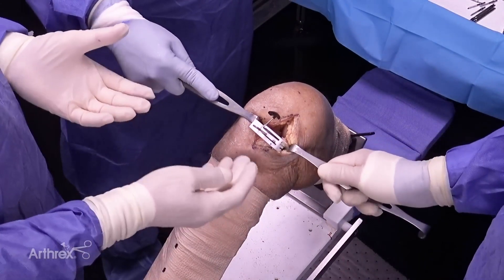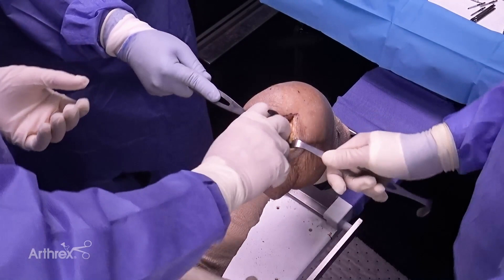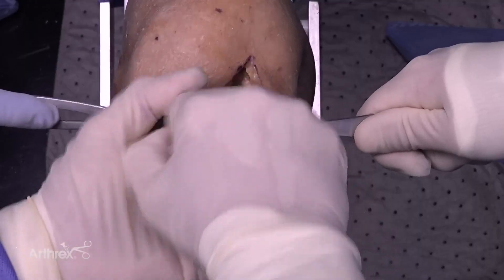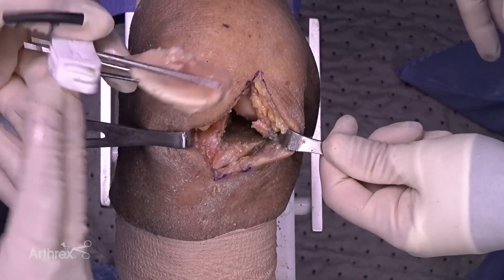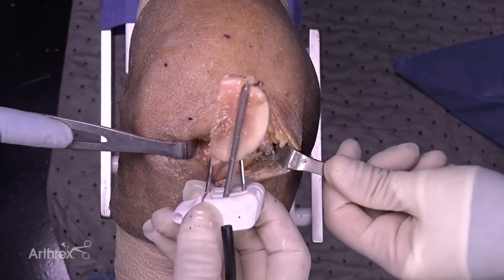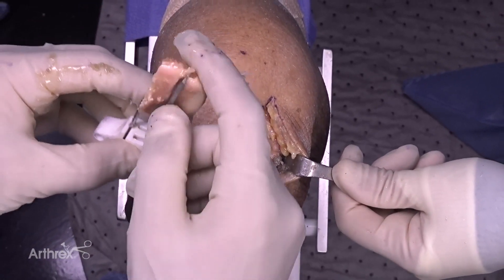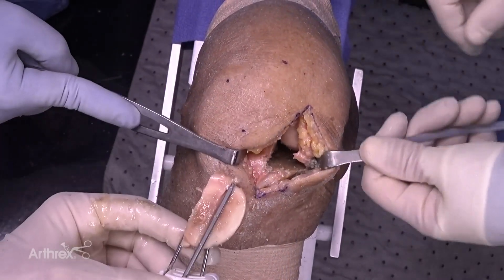Now I am done with this tibial guide — I can remove it. Depending on soft tissue attachments, removing it may actually bring the bone out with it. And if you look, there's my cut — very nice slope and depth of resection. It's a very nice cut; all came out in one. The pins were in the bone itself, and the stylus was holding right in the back of the tibia, pulling it all out.